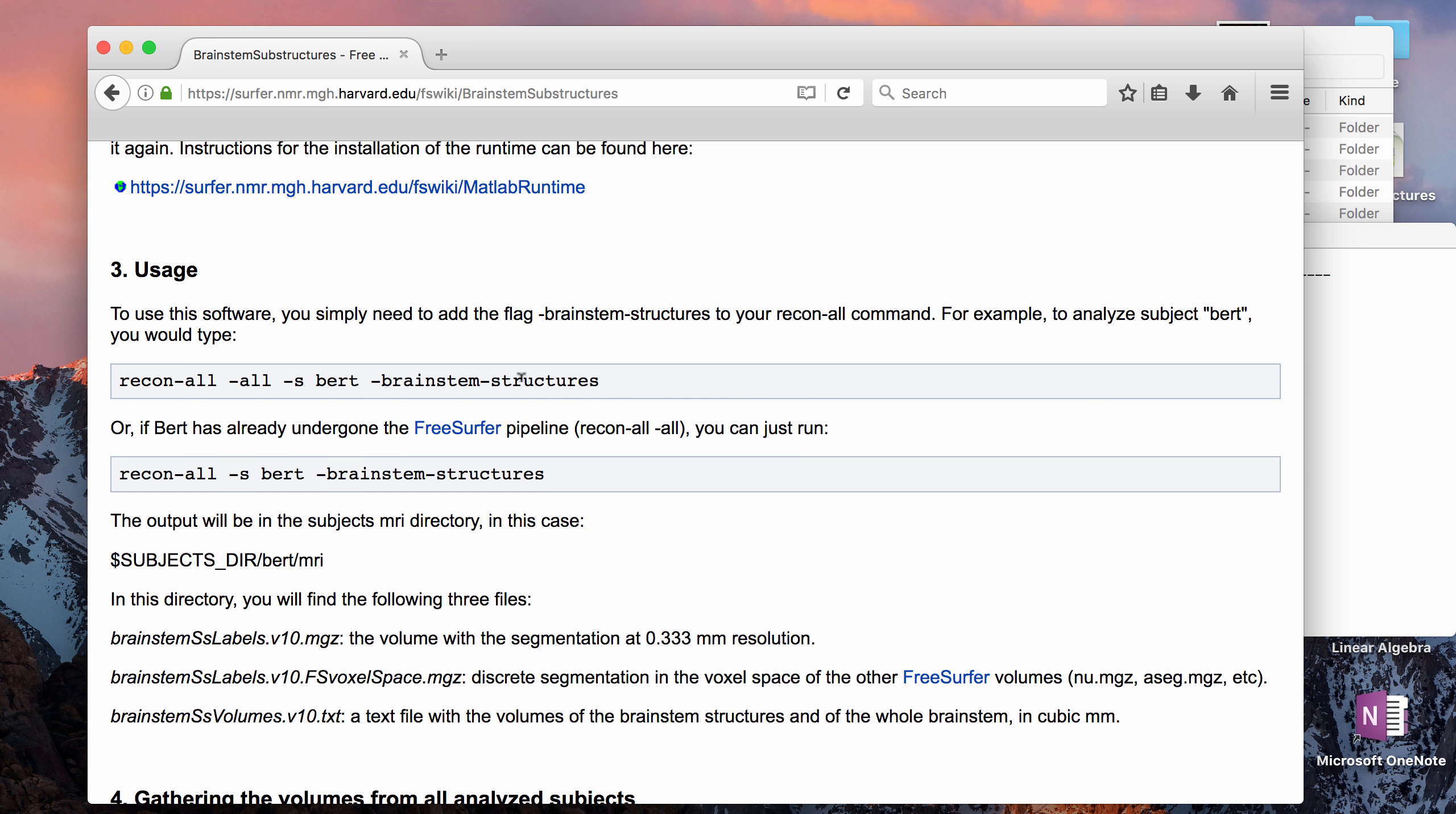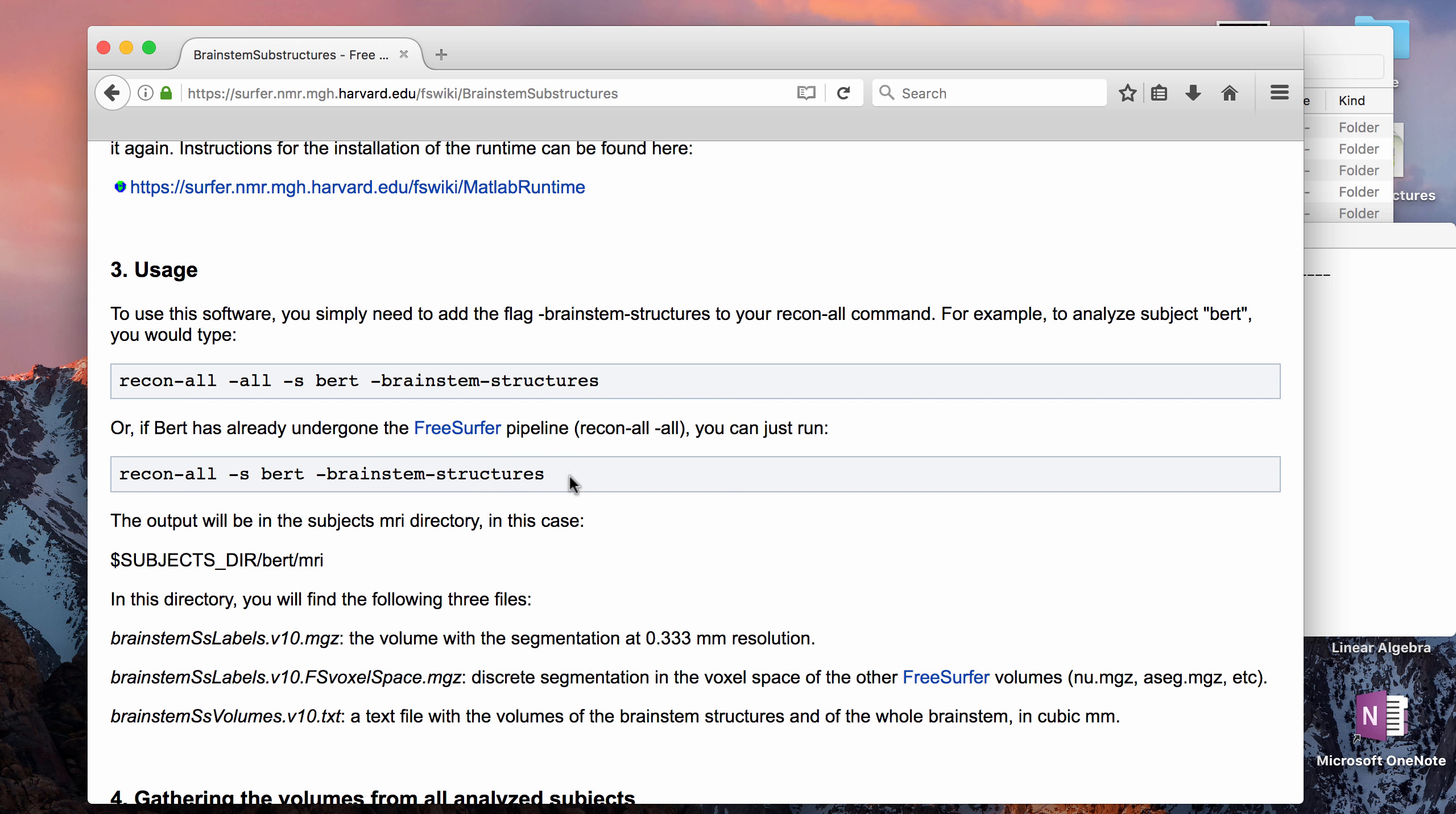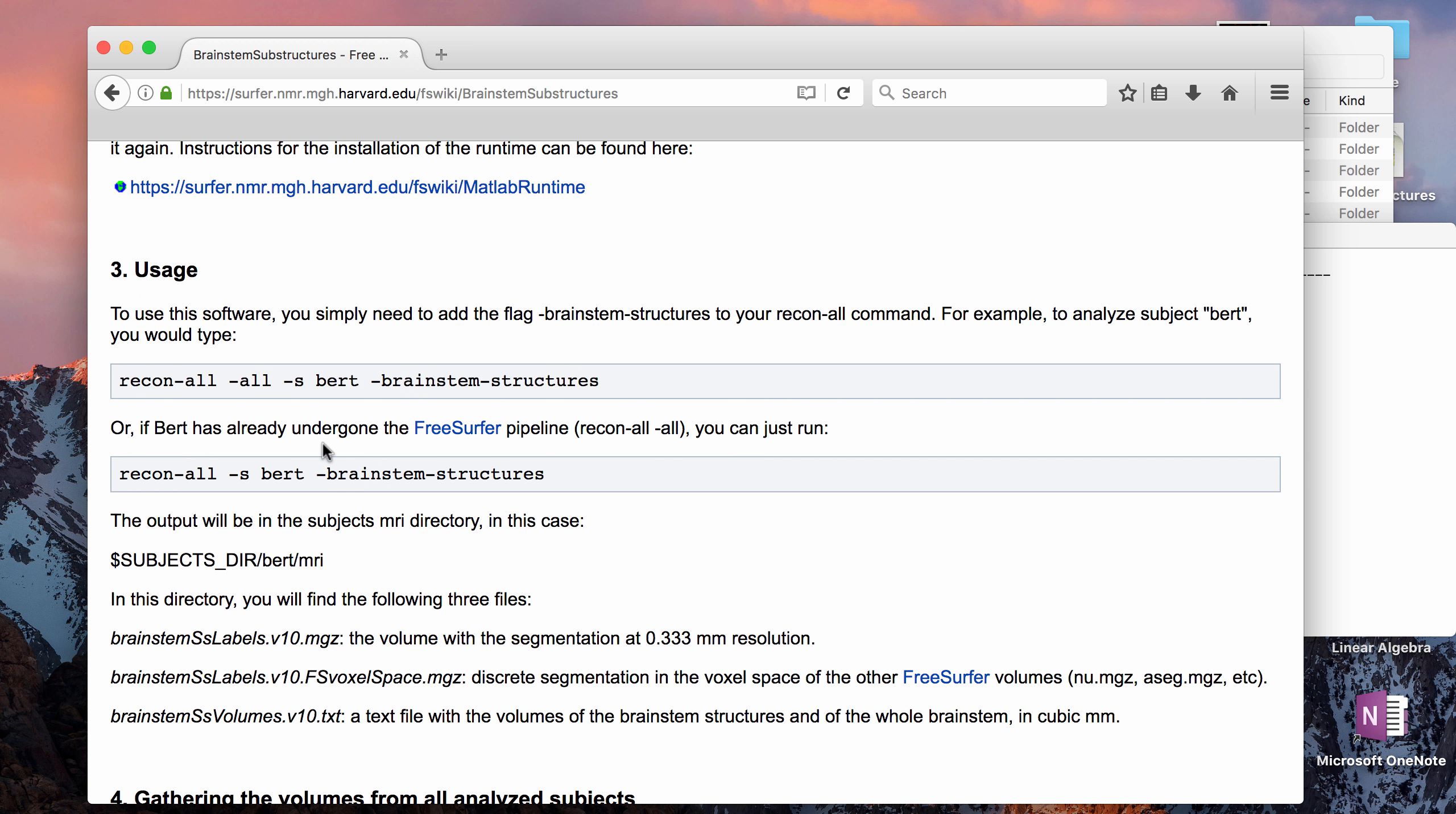To get brainstem substructures, you have to add to your recon-all tag the tag brainstem-structures. If you haven't run recon-all on your subject yet, you're going to do that and then just add the brainstem-structures tag. Or if you already have run a subject through the FreeSurfer pipeline, then you're going to remove the extra all tag and then just put brainstem-structures. For my machine, my laptop, it just took a couple of minutes extra to run the brainstem-structures tag if you've already run recon-all. Also I checked and you can run this tag from 5.3 data, so if you have a subject that you did 5.3 reconstruction on, then you can still use it for the 6.0 brainstem-structures tag.